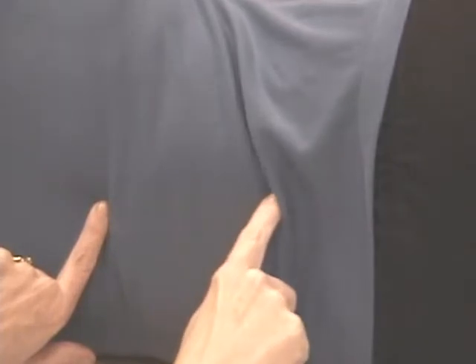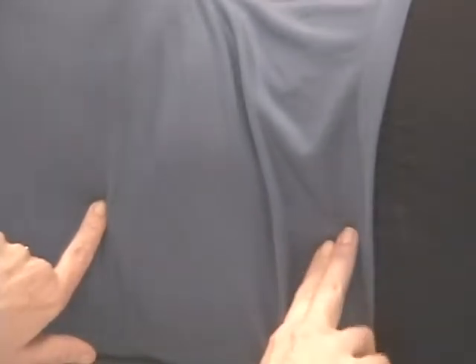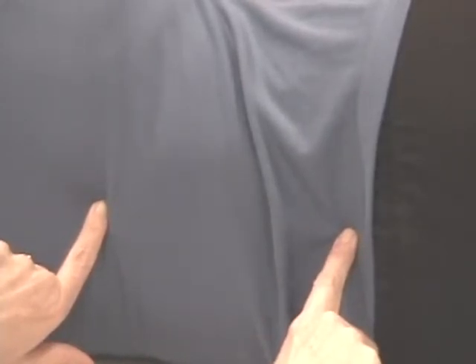You might see a spine that angles up on a lot of women. Women tend to be broader in the pelvis, so the spine will actually kind of swing itself up. The reason I'm analyzing the spine here is you want to be perpendicular to the spine. So when I'm going to do my big film on Andrea, this patient, most of her lumbar region is parallel to the film. So I'm going to shoot perpendicular.